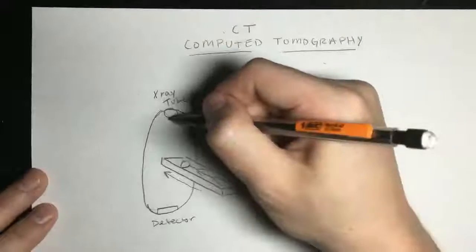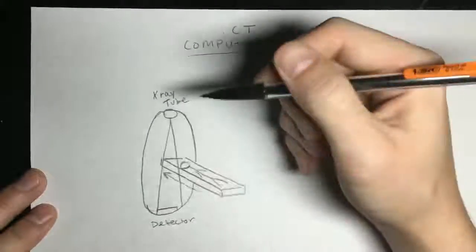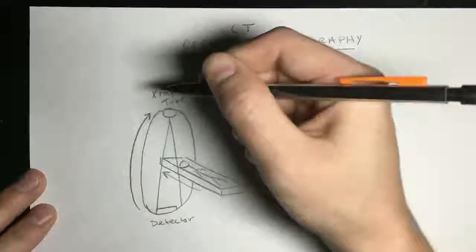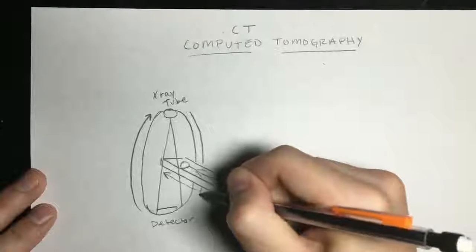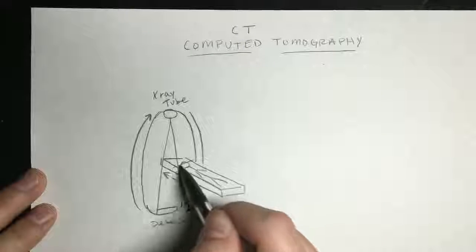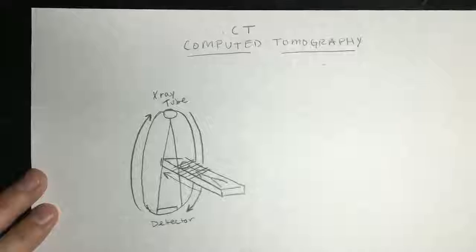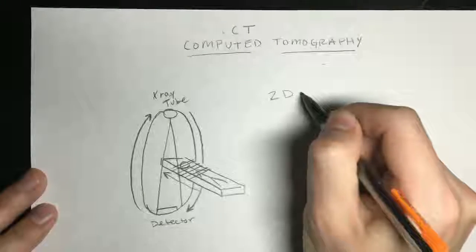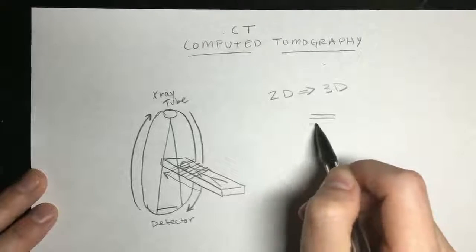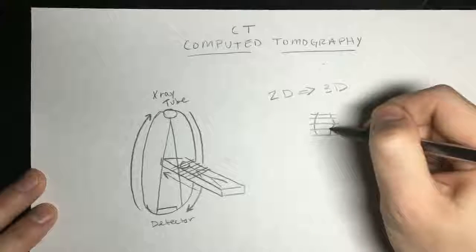So as I said previously, there are still X-ray tubes in the CT scan, and there's still a detector, and the X-rays still diverge from the source, and the difference in attenuation coefficients and how it's absorbed in the body is what yields this image. Now, when the CT starts to revolve around the patient, the patient is slowly sent in, and the CT takes hundreds and hundreds of cross-sectional images, which it then compiles to create the 3D image that results.